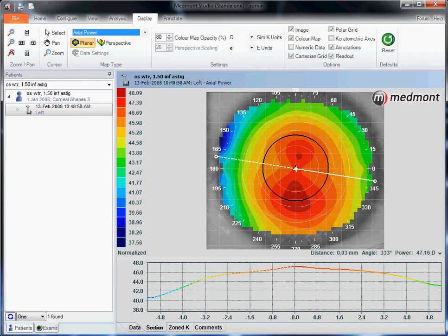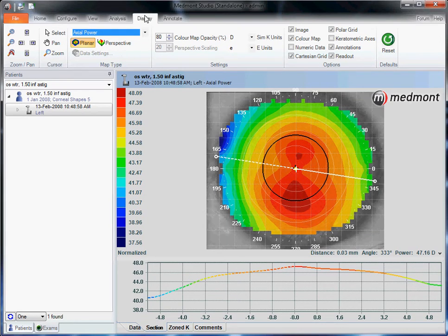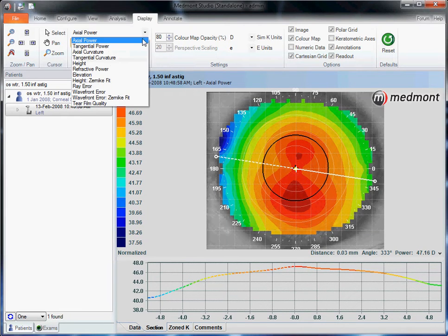This video describes the interpretations that you can do with your Medmon E300 corneal topographer. Select a map or numerous maps, go up to display, and under the pull-down menu here, you'll notice a series of options: axial, tangential, elevation, and so on.